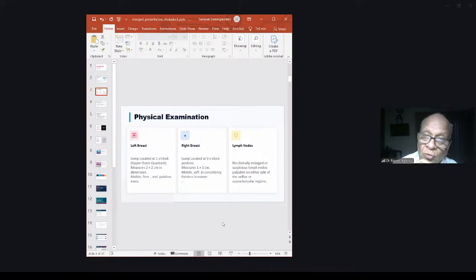Somebody says BIRADS 2 for the same lesion, somebody says BIRADS 3. That is true. So, ma'am, how do you guide us? What should we do if there is any change of opinion in terms of BIRADS category? If you're following a lesion in 6 months, it's always good to go back to the same place where you did it.